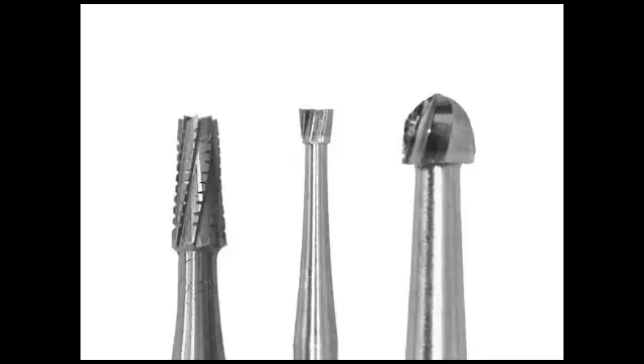Midmark recommends using carbide burrs only once, as they are never as sharp after the first use. Using a dull burr means that each additional procedure will take longer and the operator may be tempted to apply too much pressure during use, which would reduce the life of the handpiece turbine. Regardless, burrs should always be removed after use to allow for proper cleaning of the handpiece.